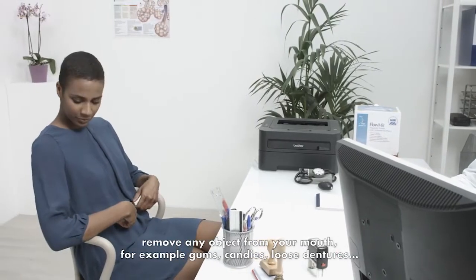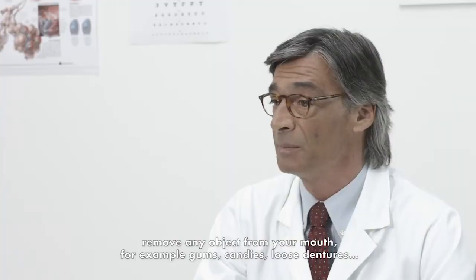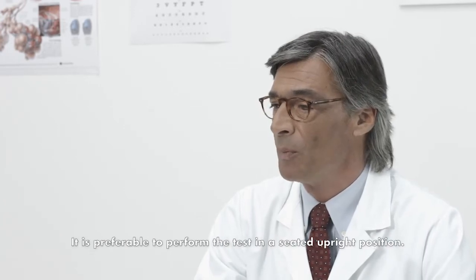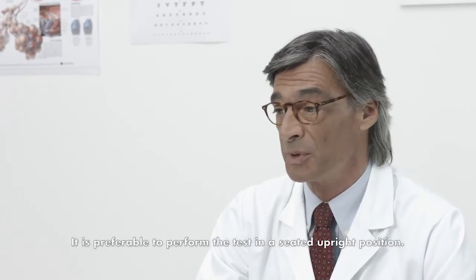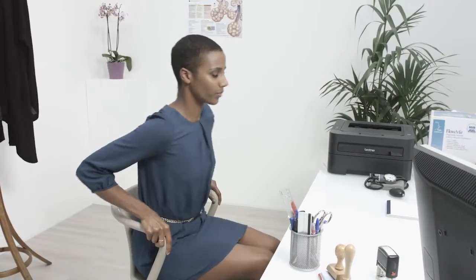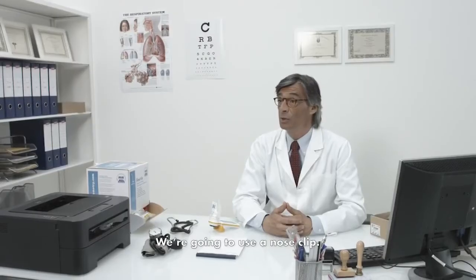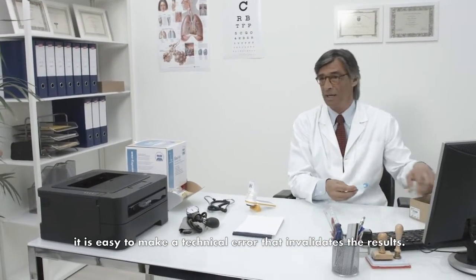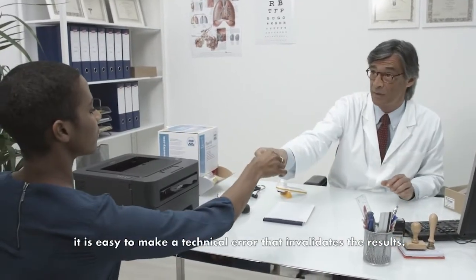Please remove any tight clothing. Remove any object from your mouth, for example gum, candies, or loose dentures. It is preferable to perform the test in a seated upright position. Don't lean forward and don't cross your legs or feet. We are going to use a nose clip. If the nostrils are not blocked, it is easy to make a technical error that invalidates the results.